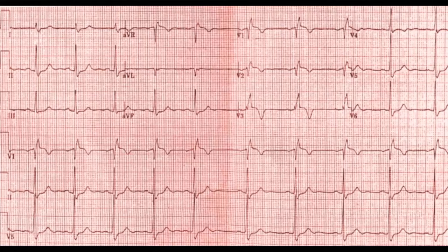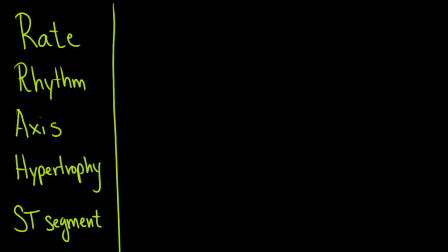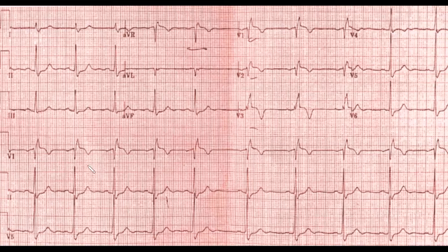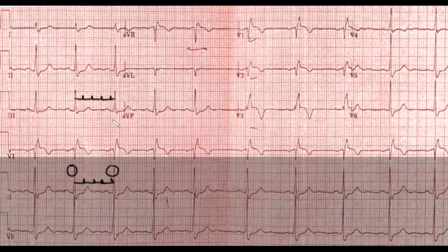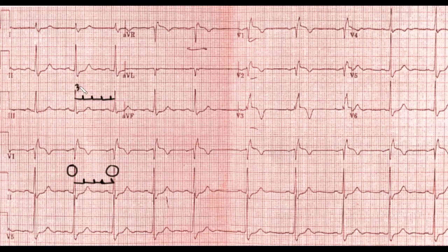Let's go through our evaluation using the five-step process. The first thing we want to look at is rate. We pick the QRS complex and count boxes between complexes. We can see one, two, three, four boxes and a little bit more — consistently across multiple complexes.